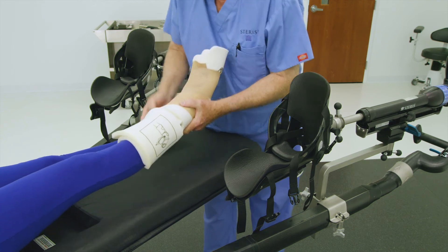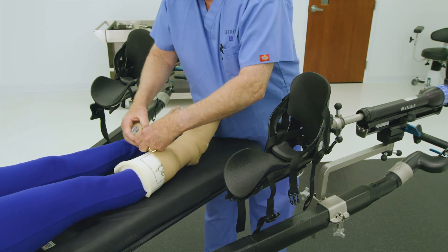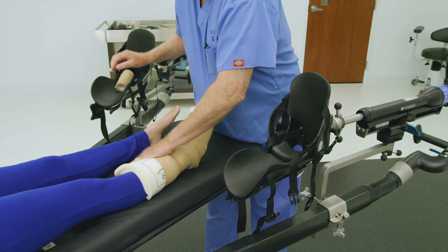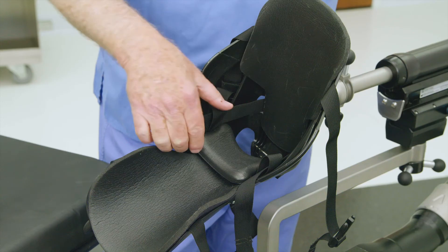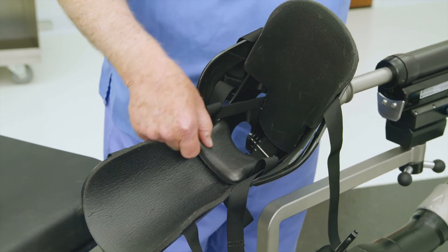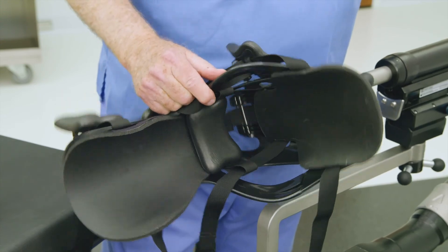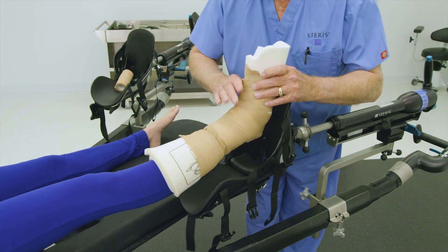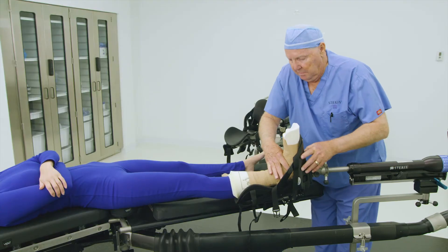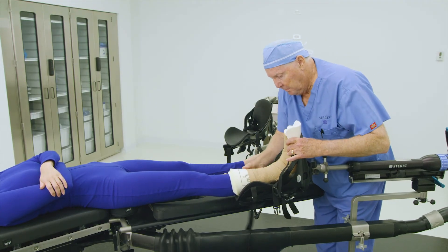If using the Steris disposable pad, instructions for placement are located on the disposable pad itself. Once the foot is prepped with padding, ensure that the floating Achilles tendon pad is positioned appropriately as shown here and is not stuffed down into the heel area. Place the patient's foot into the boot so that the heel rests against the bottom footplate, and the foam padding shown here is as close to the patient's calf as possible.